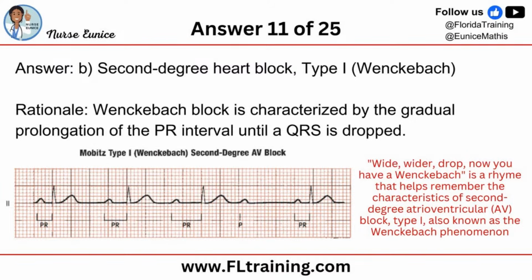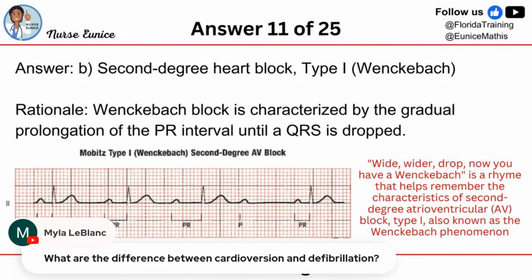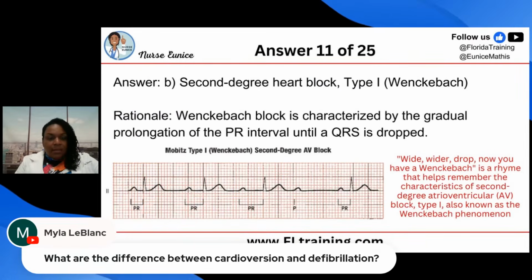And let me go back and answer Mila's question. All right, and so Mila wants to know what is the difference between cardioversion and defibrillation. So even though the device, when we call for the crash cart, the defibrillator has multiple modes. And so one of the modes is cardioversion. Cardioversion is what is used, and we put a term in front of it called synchronized. Synchronized cardioversion is what we use to slow down someone's heart rate when they still have a pulse and the heart rate is fast. So this person is more likely still talking to you.